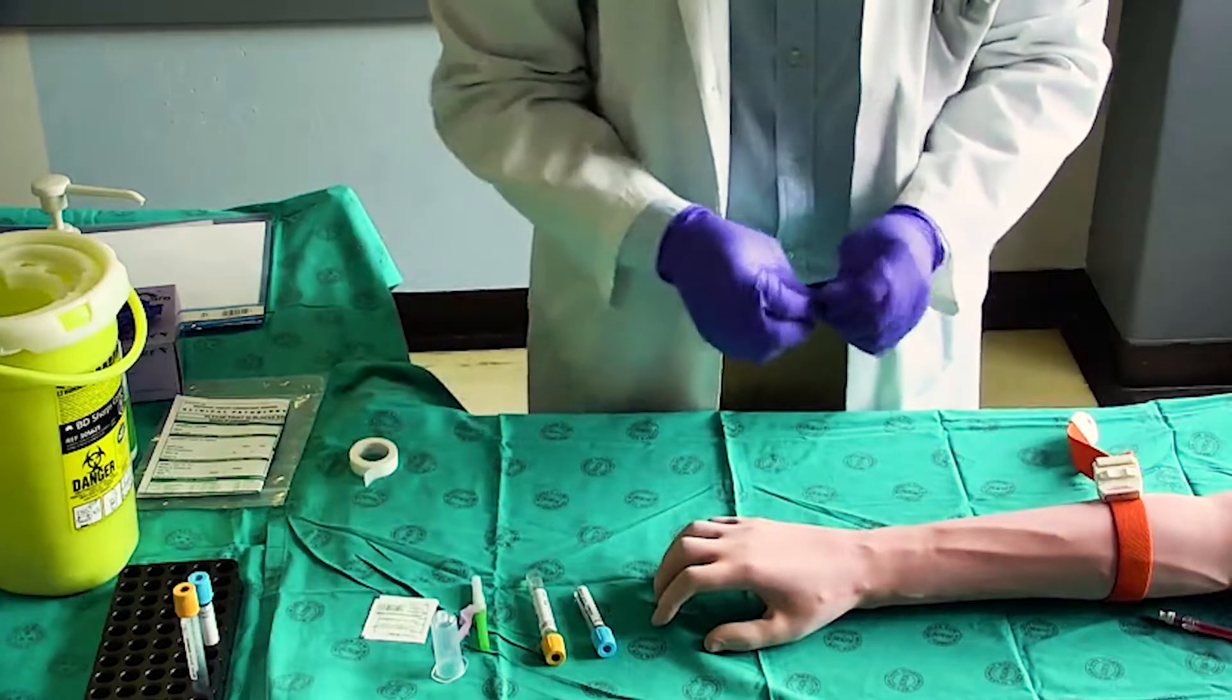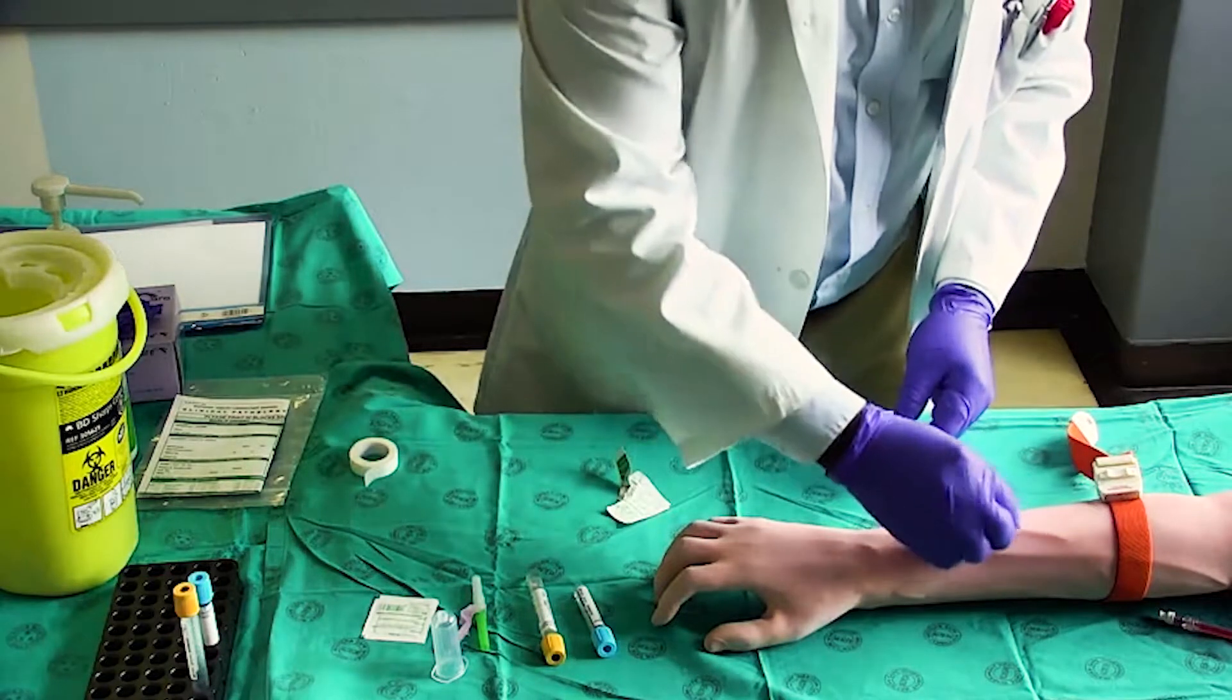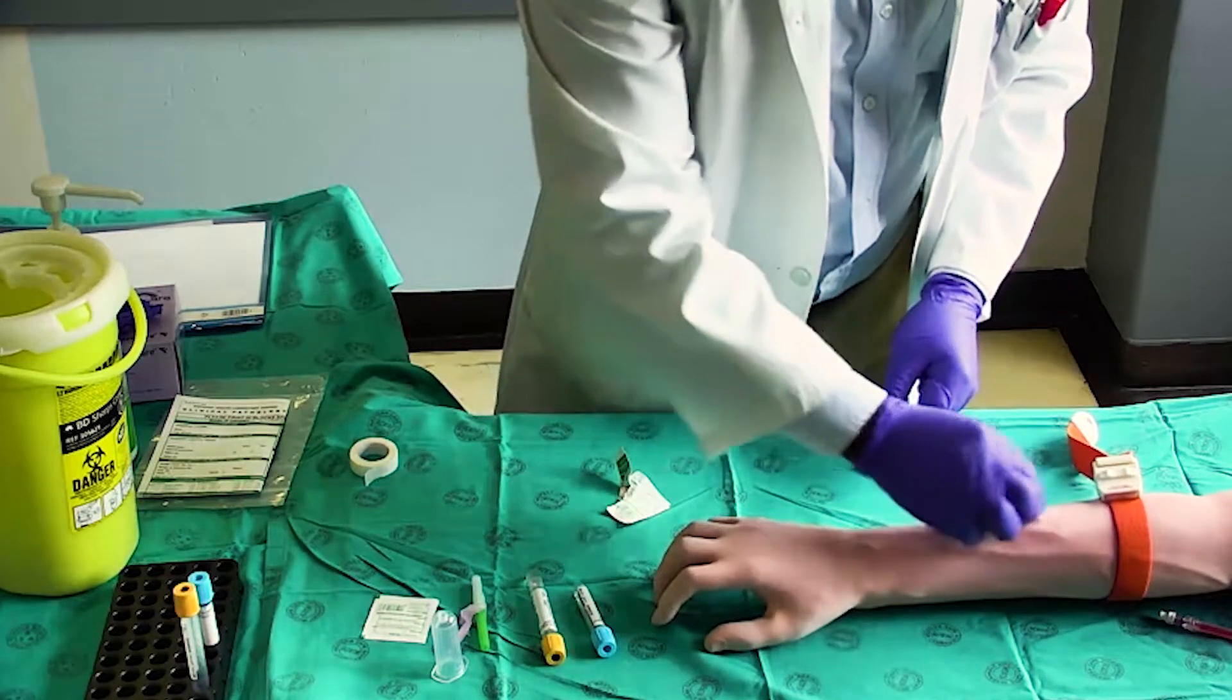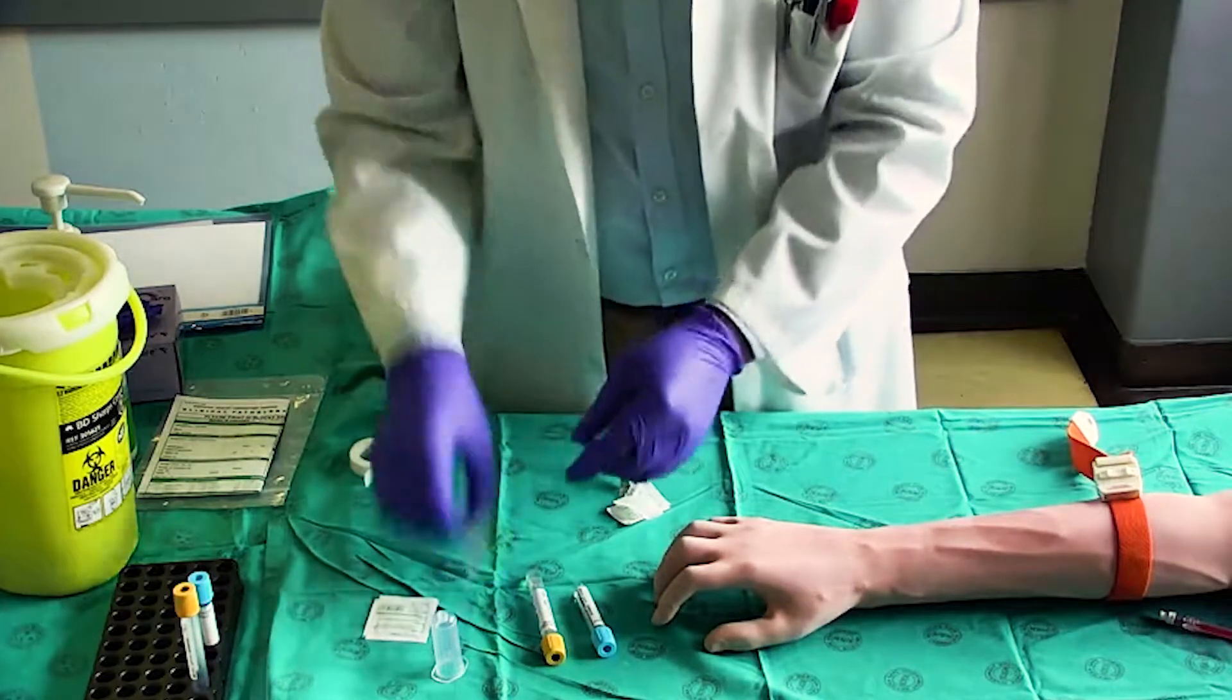Clean the skin with an alcohol swab for 30 seconds in a circular motion from the center outwards. Allow the skin to air dry for 30 to 60 seconds.